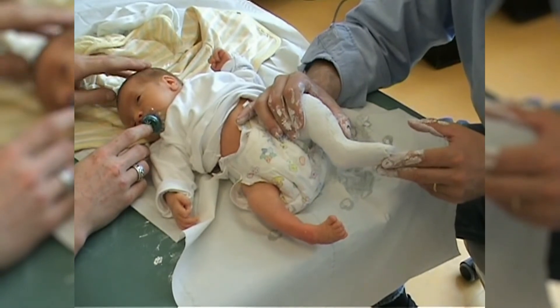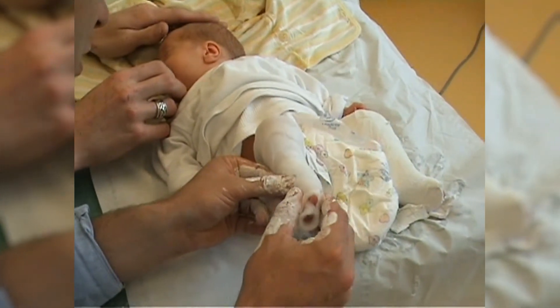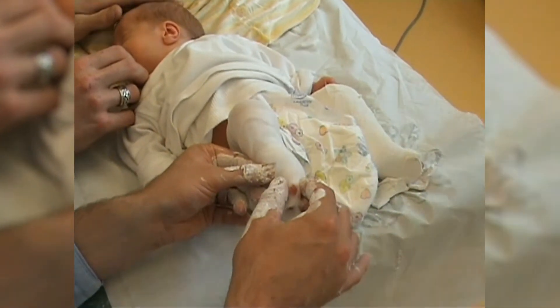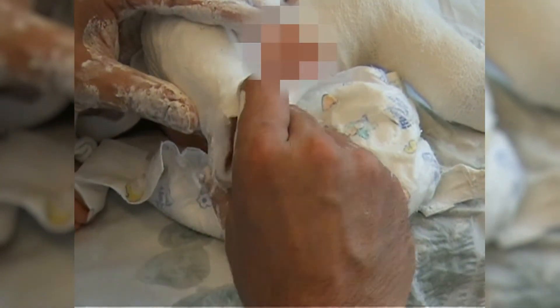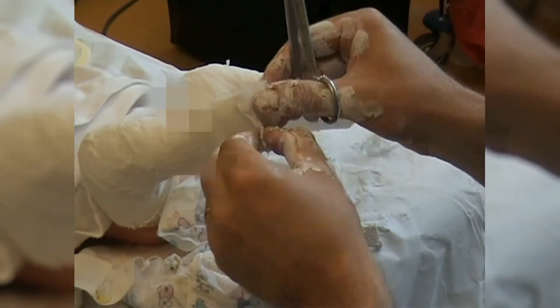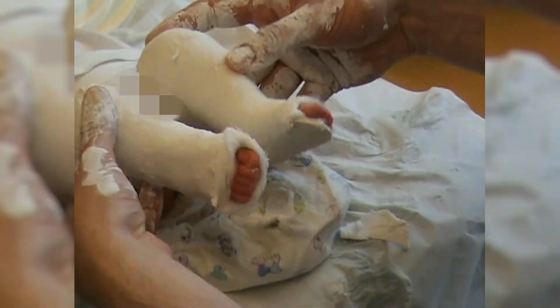The baby does not appear to be disturbed by this. Here you can see once again the supination position of the foot in the first cast. The plaster cast is applied in the same way to the right foot — supination by raising the first ray against the fixed talus. By constantly moving both hands we can avoid pressure sores developing on the skin, especially over the talus. Ultimately all toes are freed from the cast. A final look at the cast shows the supination position of the feet.